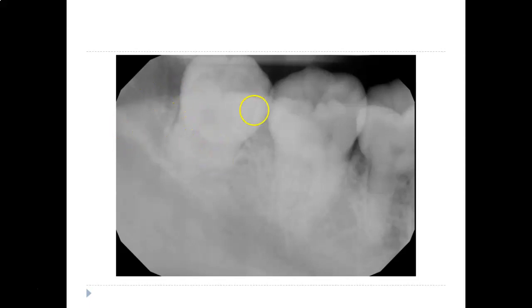You leave the sensor as far back as you can get it, and if that is not anywhere near centering the second molar, then you just get it back as far as you can. You push your BID back, and then you angle it more mesial so that you're covering the sensor. And then, we'll see if it works. I'm very excited to try it out.